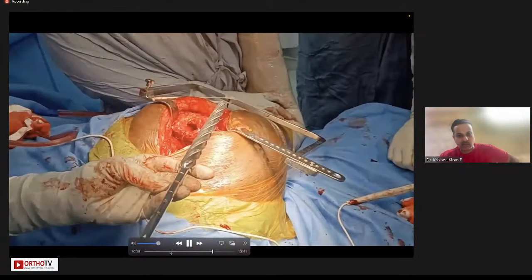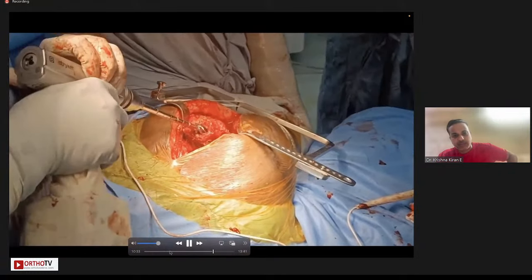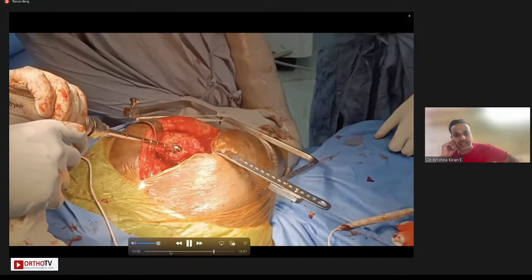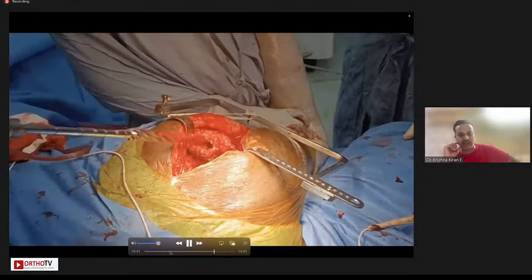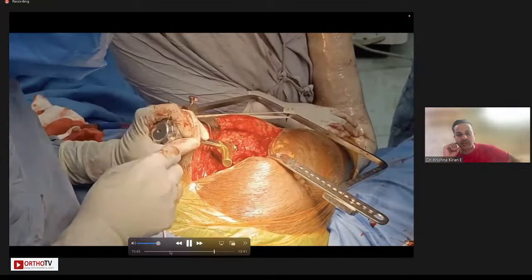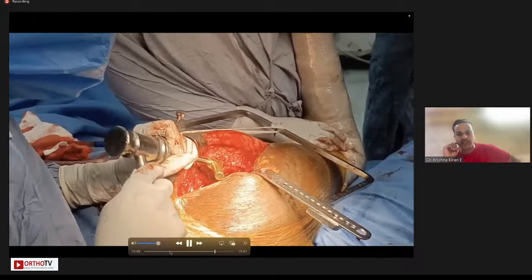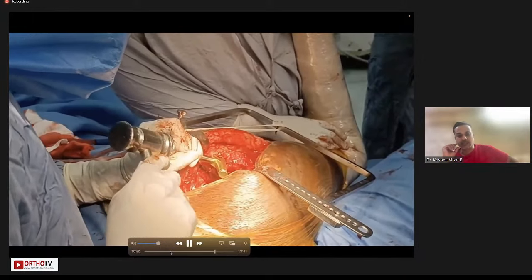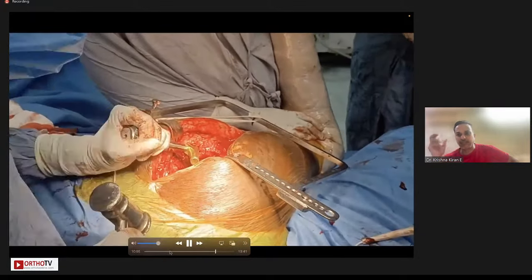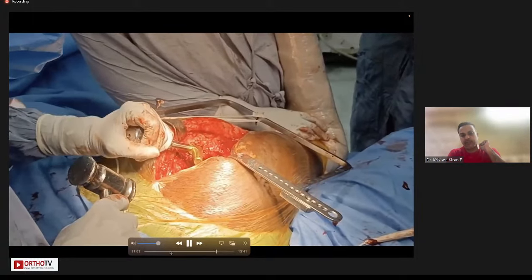So this is a non-modular fluted stem, which is titanium and which has got multiple flutes on it for additional stability, and it is grit blasted. And this is a standard of care for most of the revisions nowadays, where you use a non-modular titanium grit blasted fluted stem, and it's a conical stem. Typically the cone is around 2.5 to 3 degrees of taper, and that is what is done by the reamers, which have the preparation.